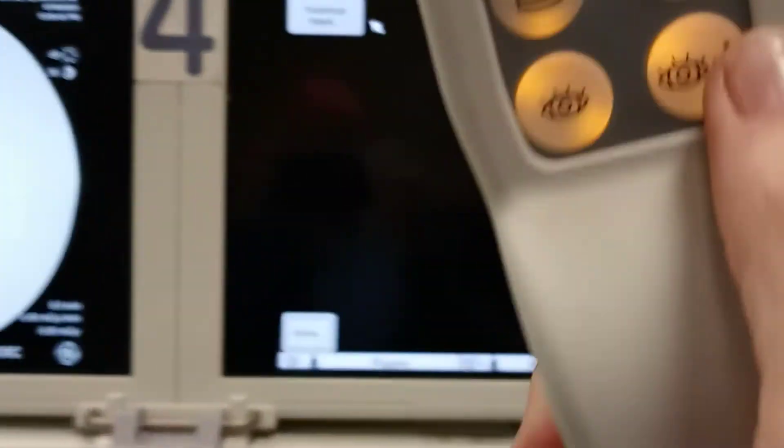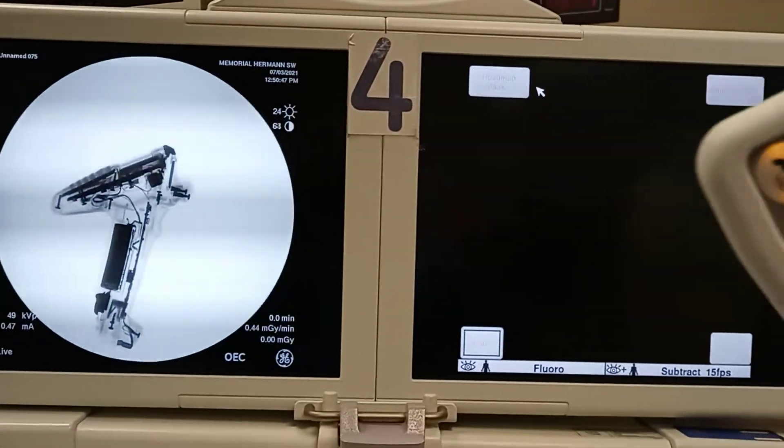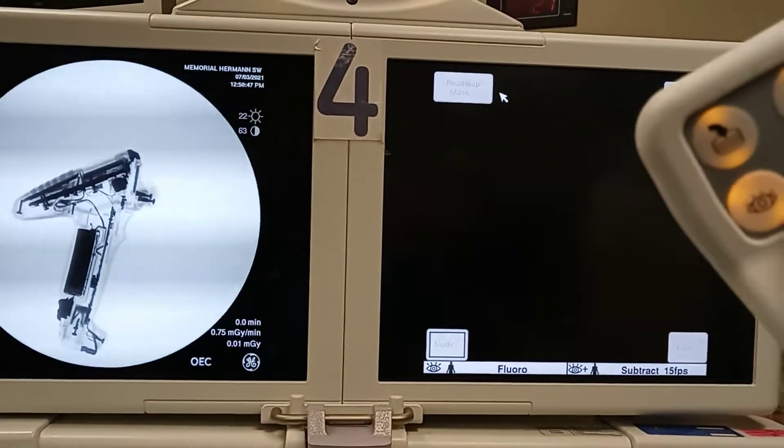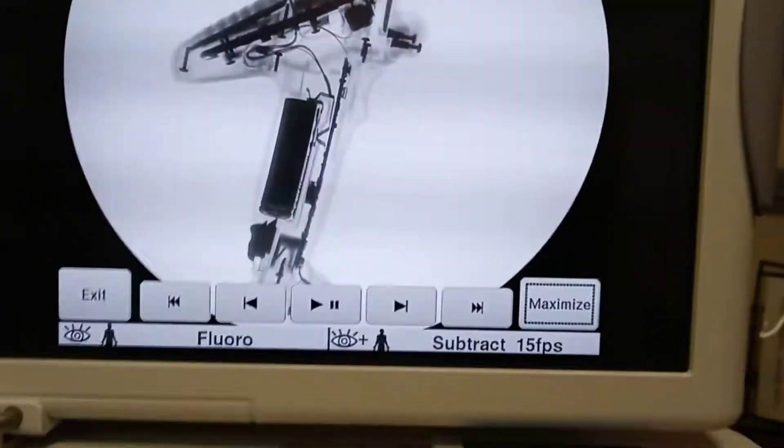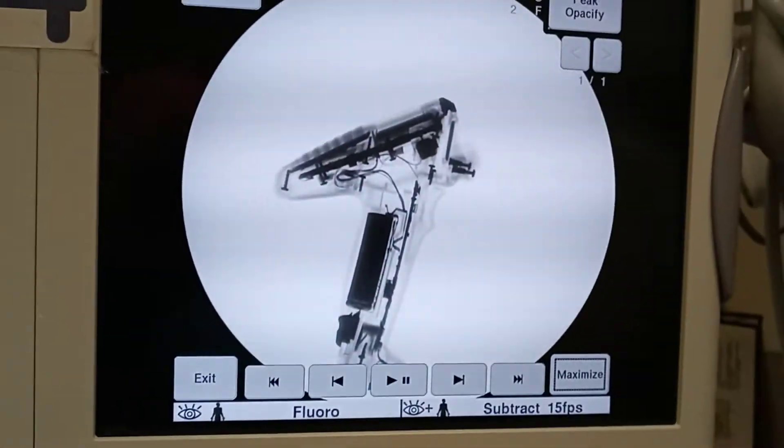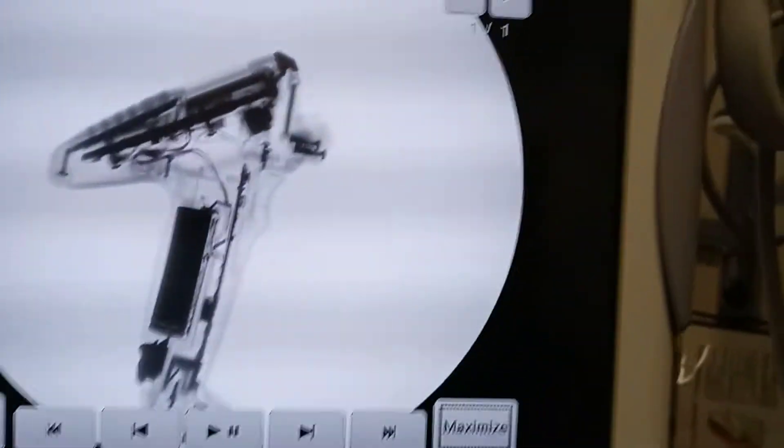So now we're ready to subtract. I'm going to subtract it out. It's popped up. Very good. This is your digital subtraction. So it's a subtracted image.